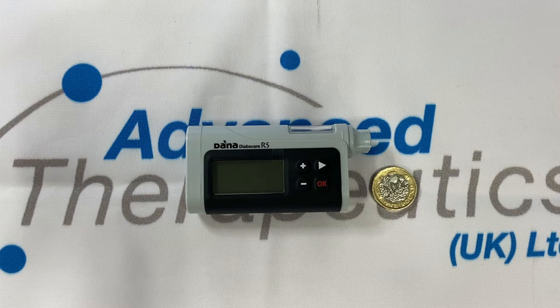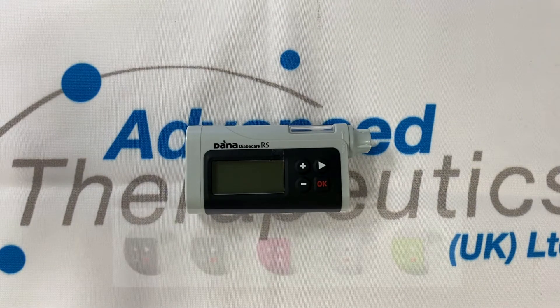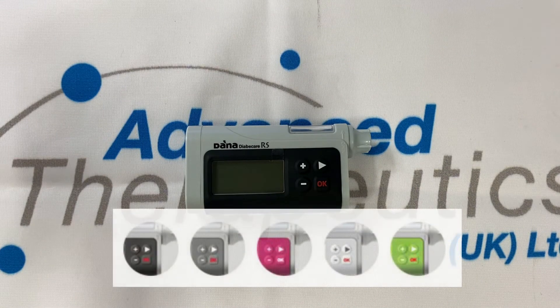It has a maximum insulin carrying capacity of 300 units and an average battery life of three to four weeks. It's also IP28 rated, so waterproof. The pump is available in a wide range of colours and with a wide range of infusion sets to choose from.